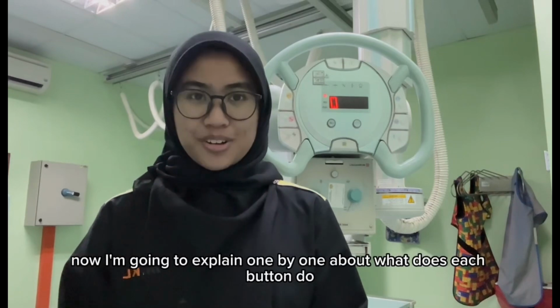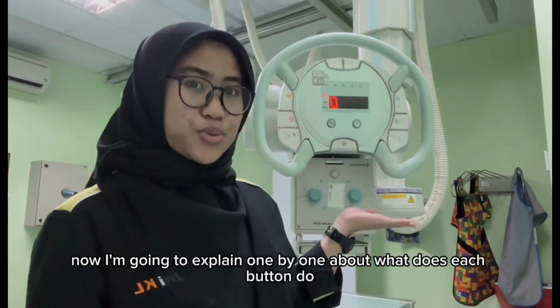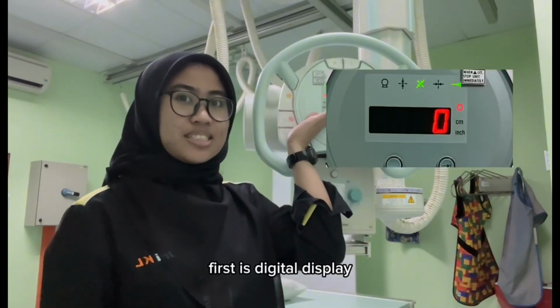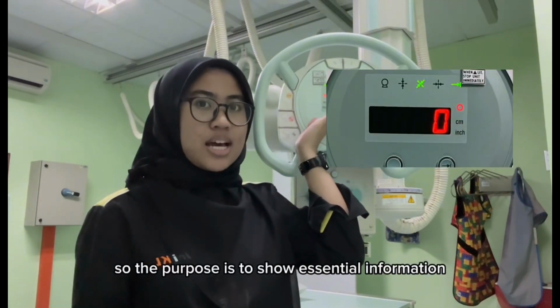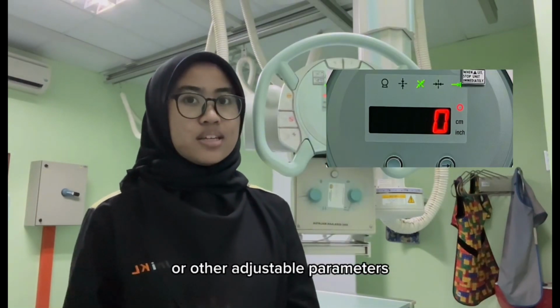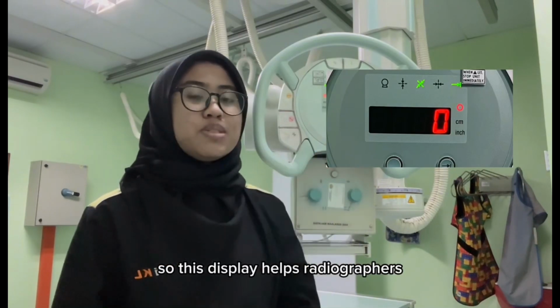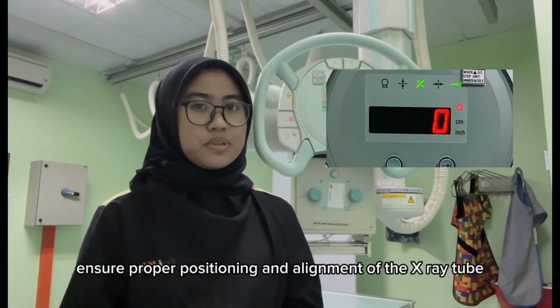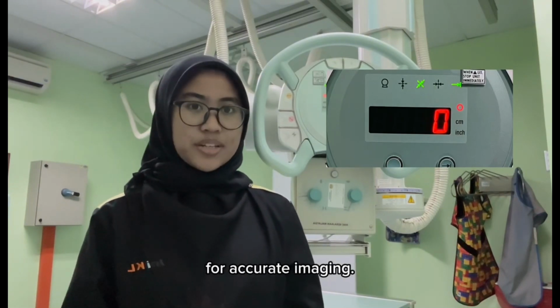Now, I'm going to explain one by one what each button does. First is the digital display. The purpose is to show essential information like the distance between the X-ray tube and the patient or other adjustable parameters. This display helps radiographers ensure proper positioning and alignment of the X-ray tube for accurate imaging.